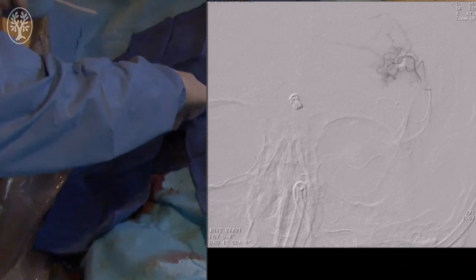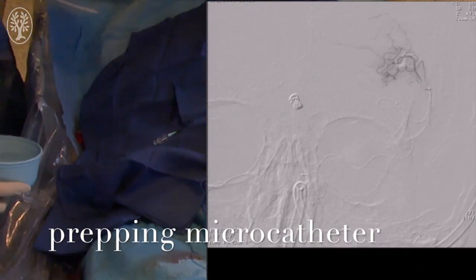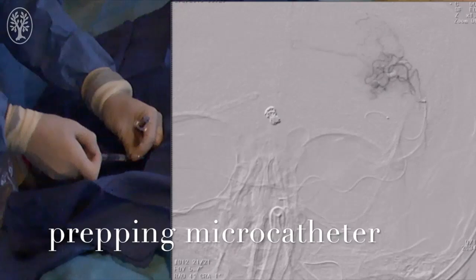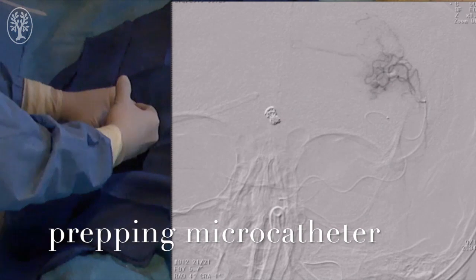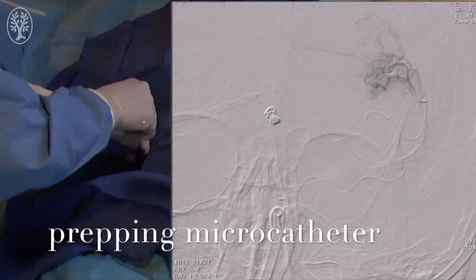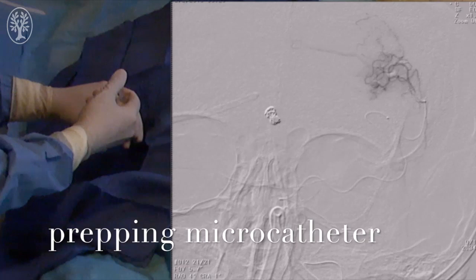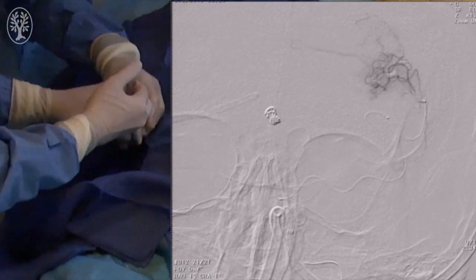At this point, we're going to perform WADA testing to make sure that if we do embolize this territory, we do not create any neurologic deficit. Once we've WADA tested the patient and they pass the WADA test, we prep the microcatheter by injecting dextrose to clear any blood product. And once the microcatheter is prepped with at least 3 syringes of D5W, we now bring in the NBCA.